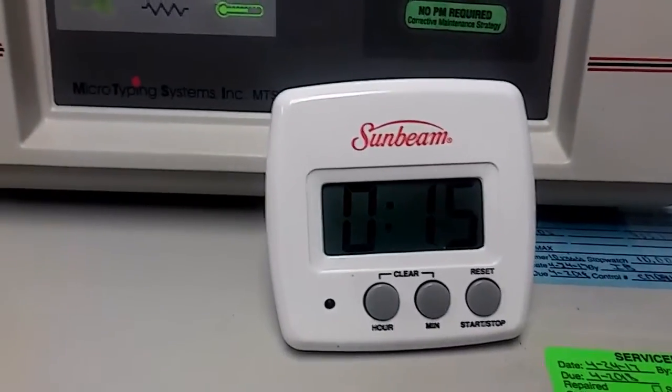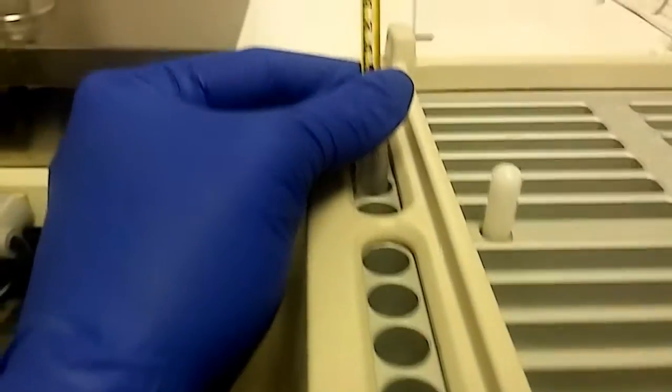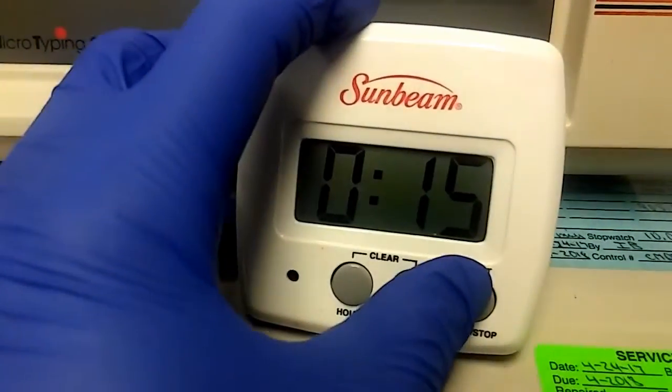Once that's completed, we're going to set our timer for 15 minutes and it has to incubate at 37 degrees. You can see it's at 37, and then timer for 15 minutes.